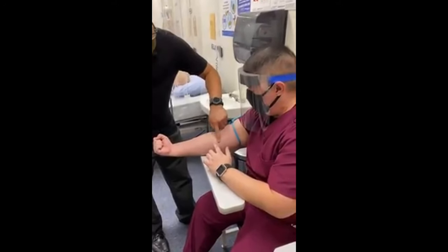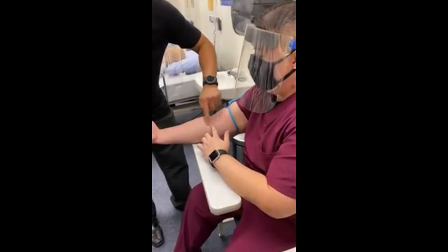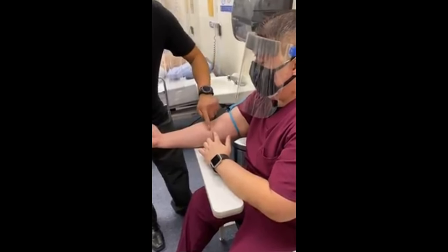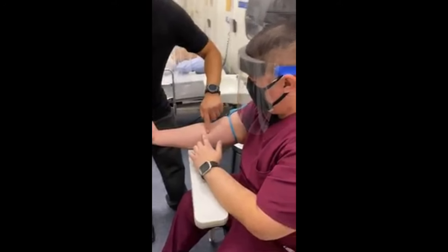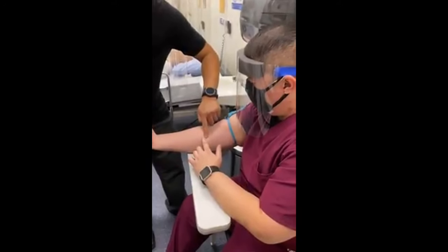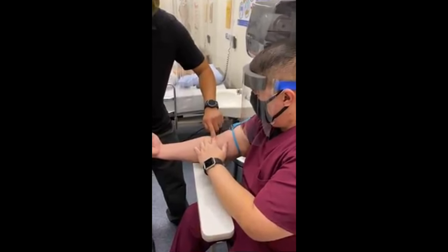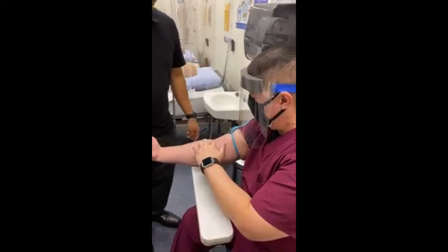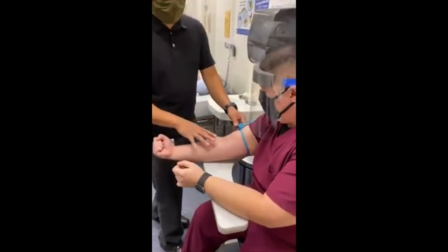should run, I think this is your best hook right here. This one? Yeah, right. It should not run sideways here. So yeah, that's your basilic vein. What you want to avoid, because sometimes, wait, actually, there's something underneath the smaller vein. Yeah, but for me, I would stick you right here. Right there, the median cubital. Okay, so just keep in mind, 1 minute is the max, 60 seconds.